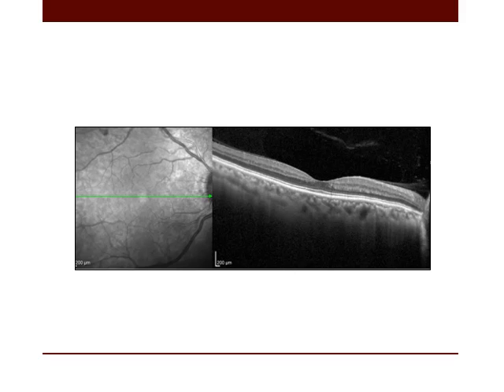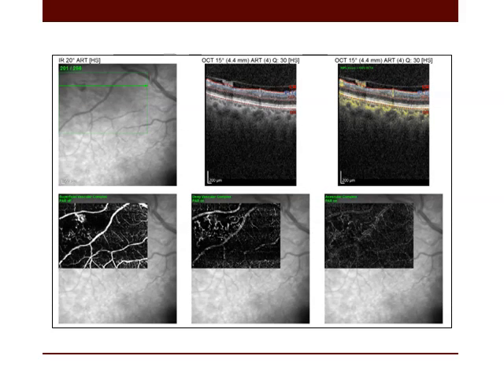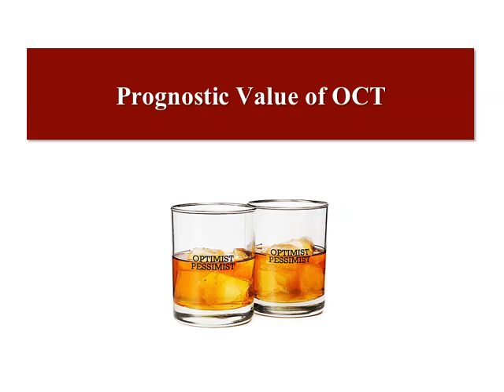In this patient, we could detect a small NVE in this area. While performing OCT angiography, the new vessels can be seen clearly, and now with the advances of OCT, it is proposed that within 10 years, all the fundus can be seen with OCT angiography, including the periphery, and no need for fluorescein angiography in the future.